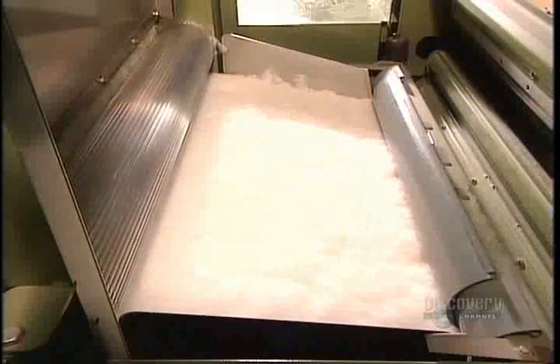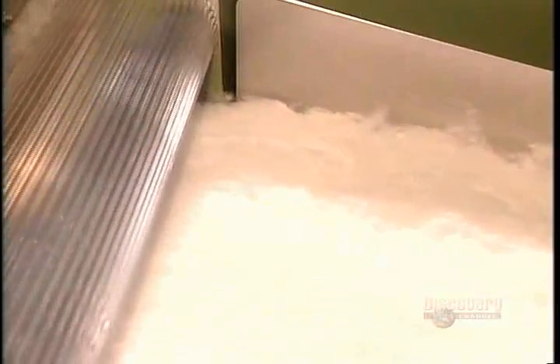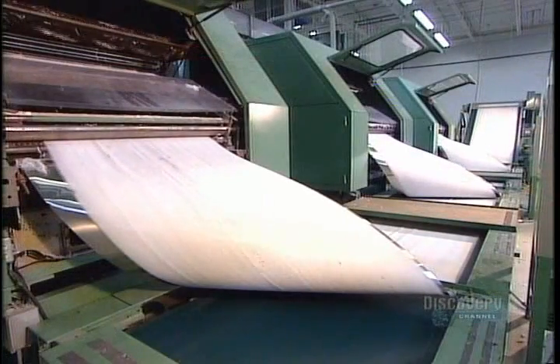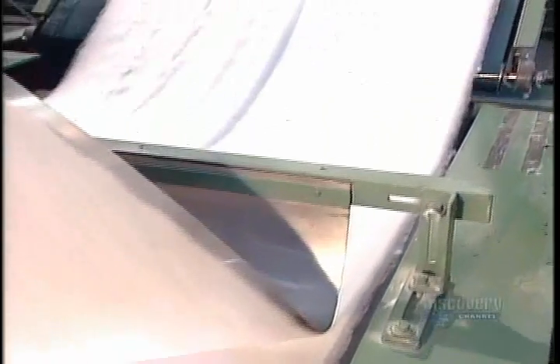Many cotton swab makers also produce cosmetic pads. Both start with bleached cotton. It arrives at the factory compressed in large bales. The cotton first goes into a machine called the feeder. From there, into a machine called the opener, which shreds the bales, pulling the cotton fibers apart. Next stop, the carding machine. Its large rollers comb the cotton fibers out. Then, guided by weight-detecting sensors, it produces a uniformly thick ribbon of cotton called a web. This web is now ready to be processed into either cotton swabs or cosmetic pads.